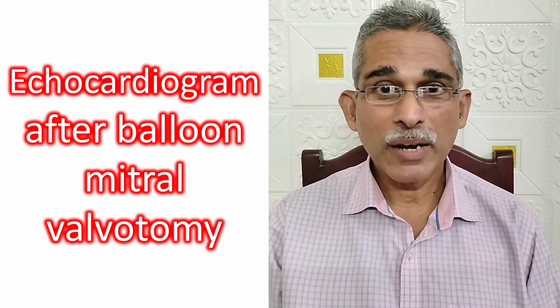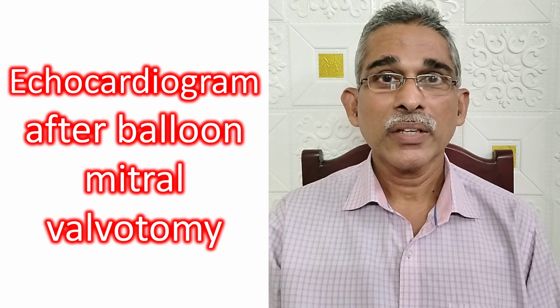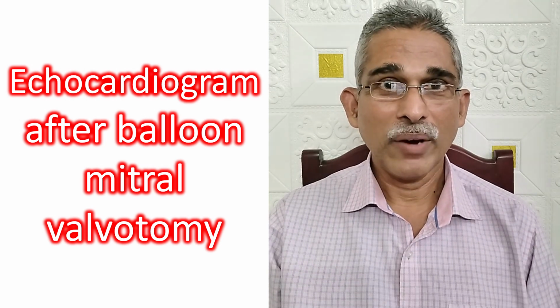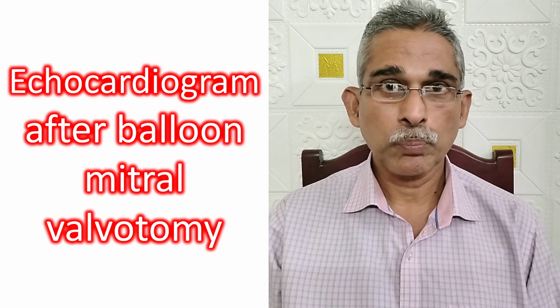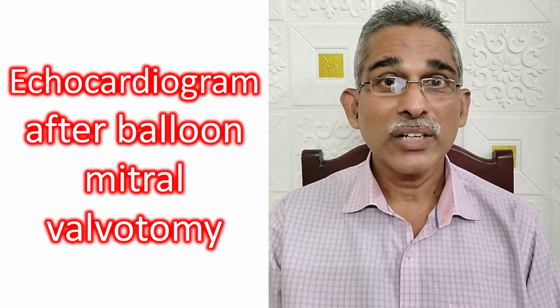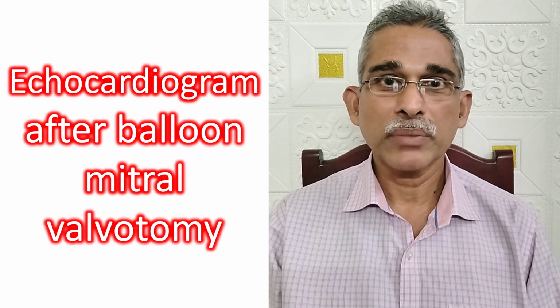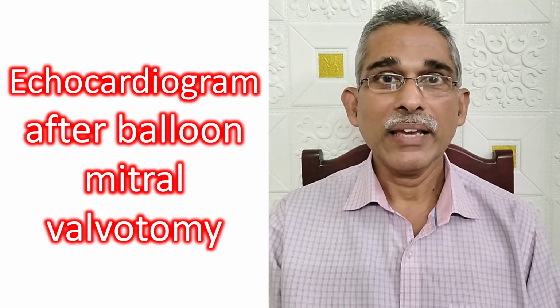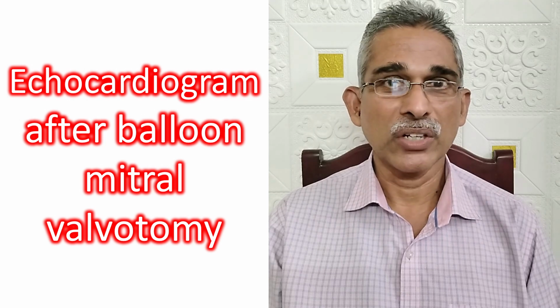If echocardiogram is available in the cath lab, it can definitely evaluate mitral regurgitation. It can evaluate the adequacy of the split, as well as if there is any pericardial effusion. Sometimes there could be some punctures occurring inadvertently and causing pericardial effusion.